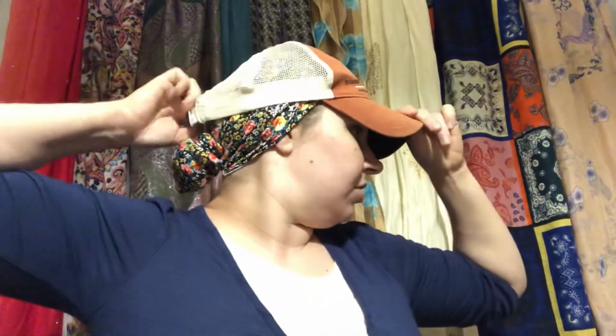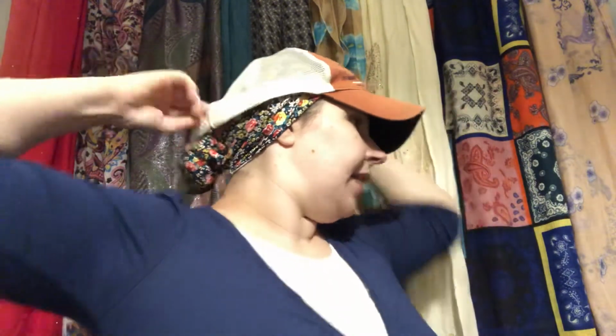For those of you who don't know, PAPR is a personal respirating system, and it has an interior headband that is adjustable. There's a knob in the back. So we'll pretend that's a knob. I'll open the knob the full way and then close it right above my bun. And then there's a plastic collar that is zipped onto the fan. There's a fan at the top that filters the air for you. It zips onto the fan, and then that cover sits very nicely under that low bun, and you don't have to worry about it pulling or anything else.